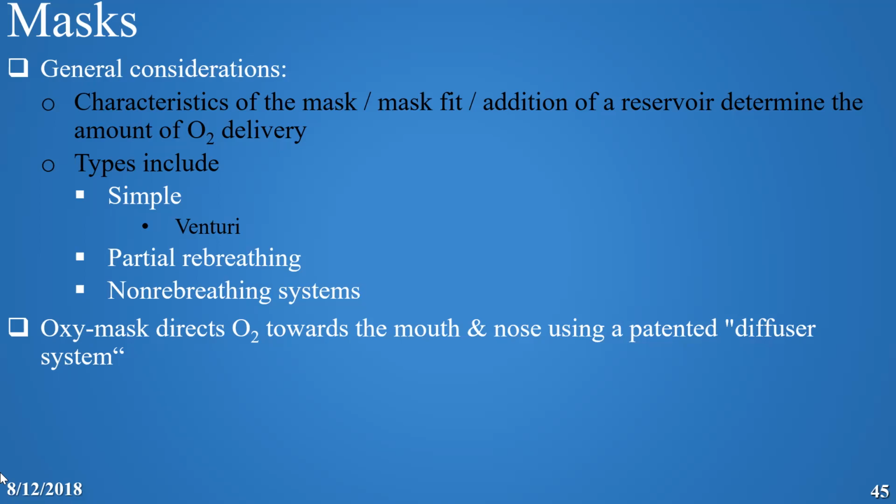Non-rebreathing, all the holes are closed. The oxygen mask is designed in a way that directs the oxygen toward the mouth and the nose.